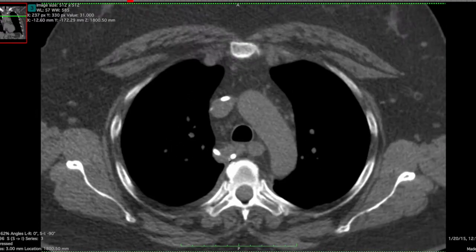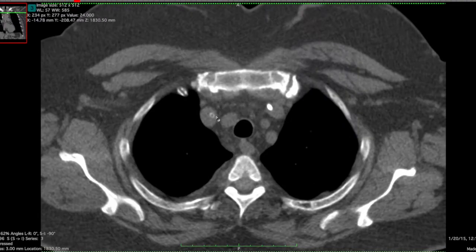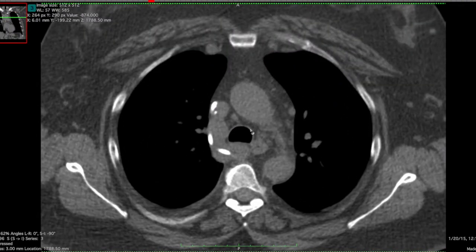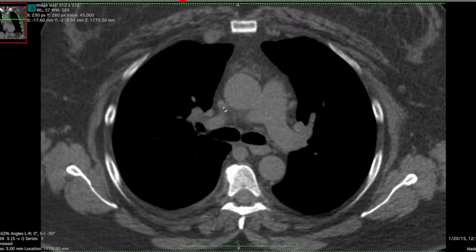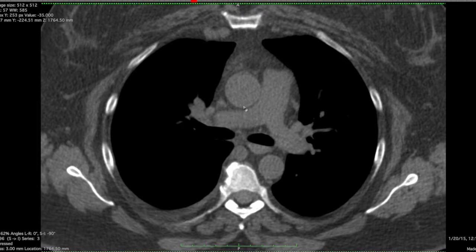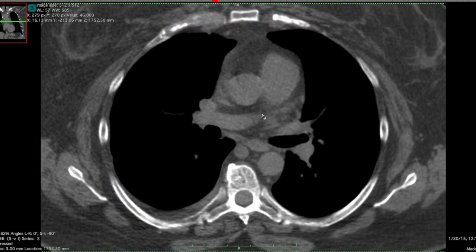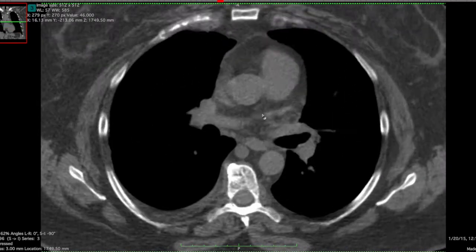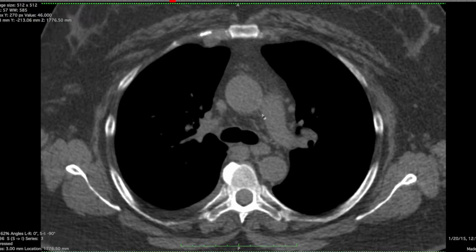So why is that? Well, this patient has had lines before — there's a little fibrin sheath left over in the superior vena cava. And as we follow the superior vena cava down, it becomes almost completely obliterated. There is clearly severe SVC narrowing, and that makes the line go into the azygous system rather than the SVC, just because there's nowhere to go in that SVC.